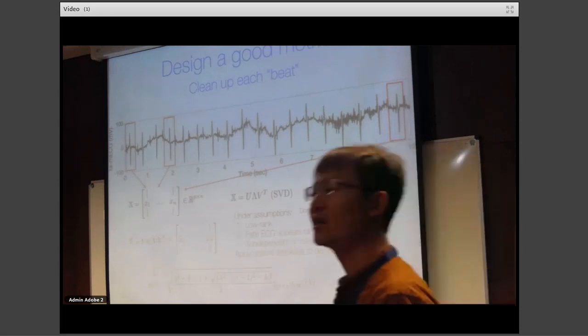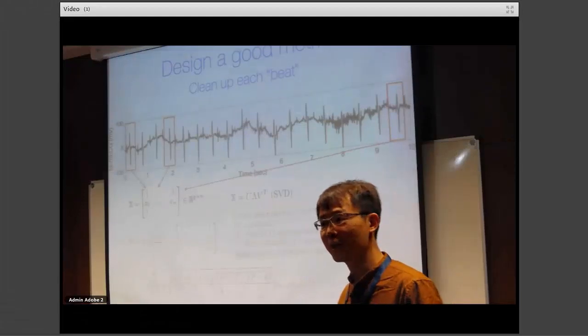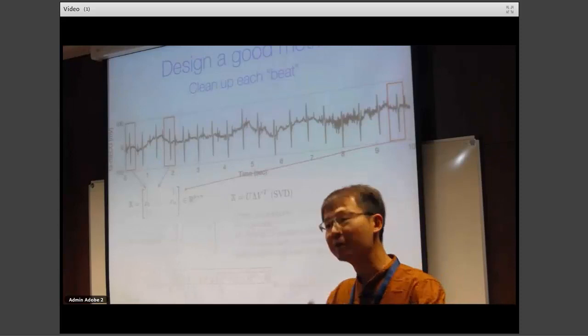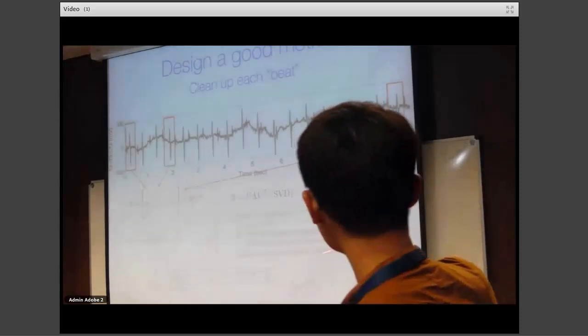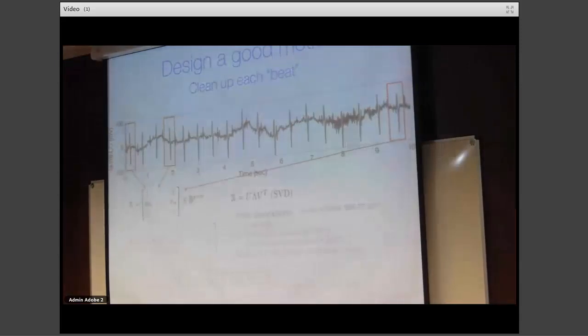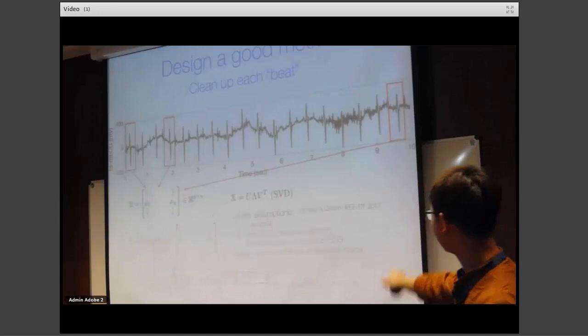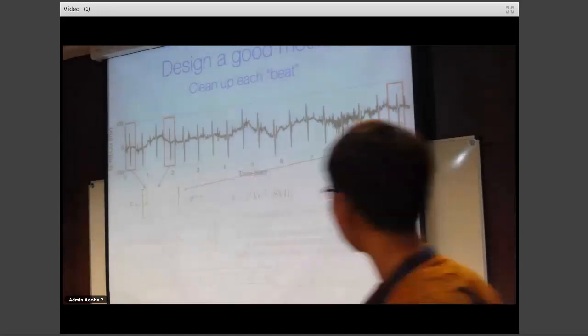Let me remind you what is the important part here. What is noise? As I discussed two slides before, noise here is the fetal ECG. And we want to recover maternal ECG as accurately as possible by removing the fetal ECG. Okay, so there have been several theoretical works in this direction. We apply an old result here. And the new result will give you a better result, but I don't show it today.